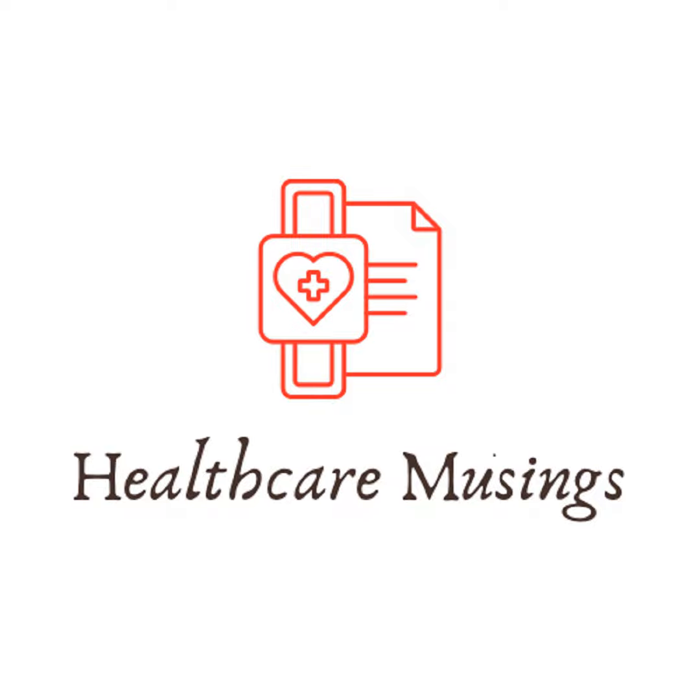Now, if somebody insists, I must have SIMV, okay? So what I do to get it to be like assist control is I just dial up the pressure support to give me the same tidal volume. I look at the peak pressure, okay, and if the peak pressure is say 20, the PEEP is at 5, so I will give them a pressure support of 15 to get their peak pressure to be 20, and that should give them a 450 cc tidal volume.